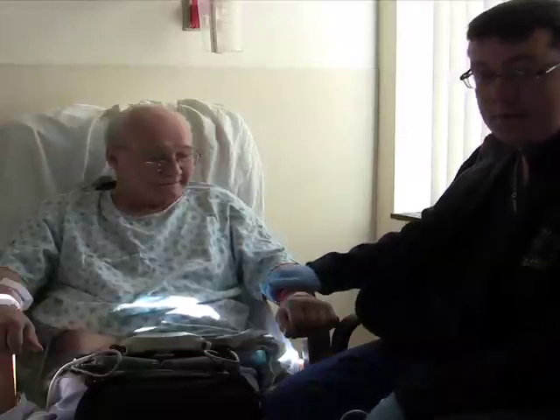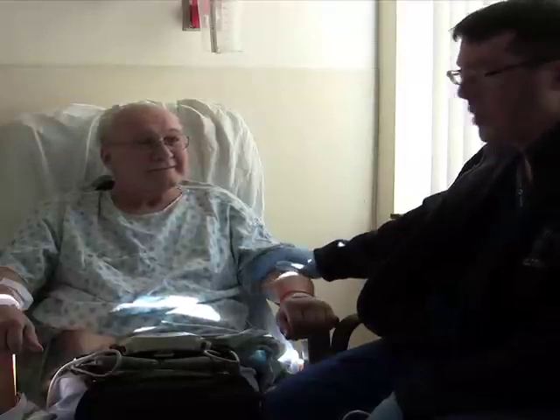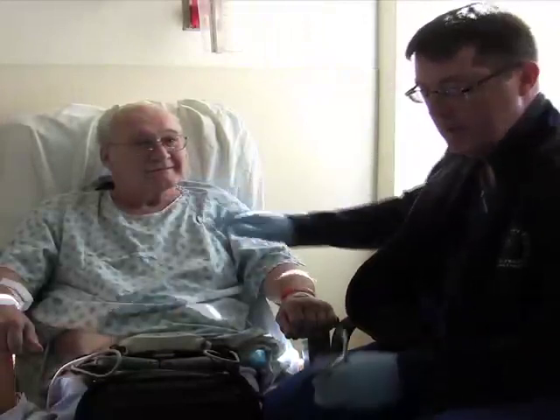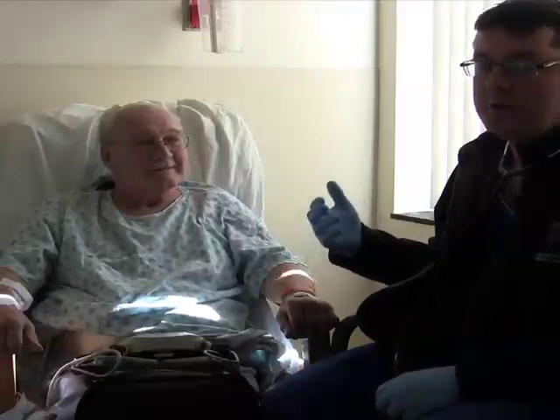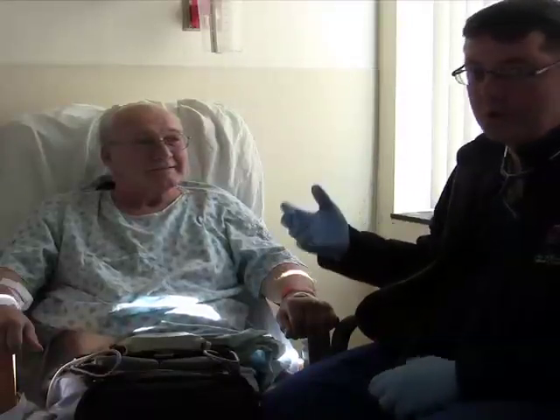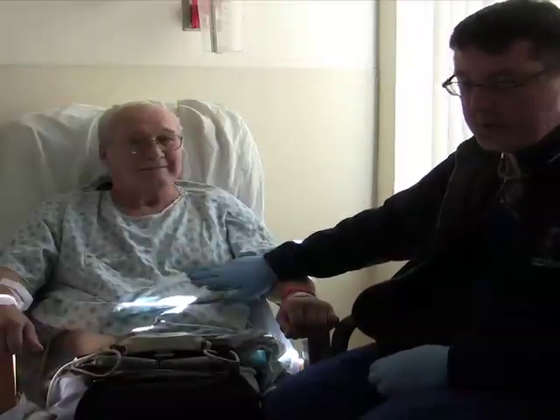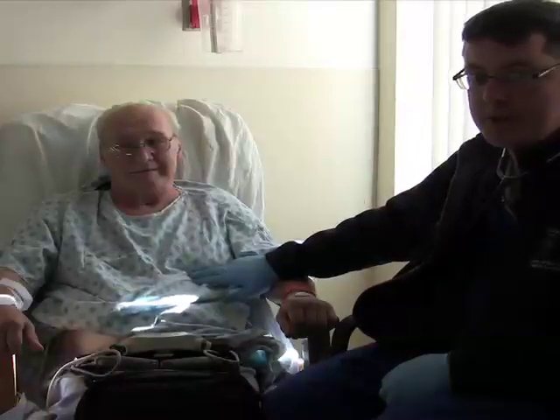The other two important findings are, first, it is extremely normal for the patient to be pulseless, meaning they would have no radial pulse, no brachial pulse, and may just barely have a carotid pulse. The other finding is that instead of heart sounds, there'll be a constant noise heard where the heart should be, a high-pitched, whirling motor noise. You can hear this if you listen right where the apex of the left ventricle should be, and you should find that pump noise right there.